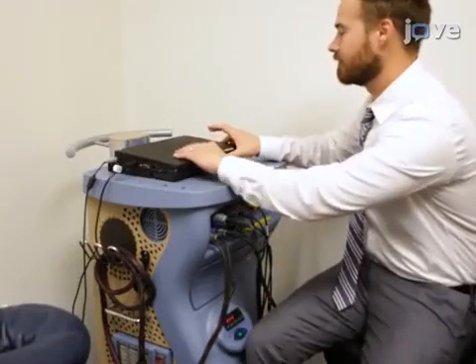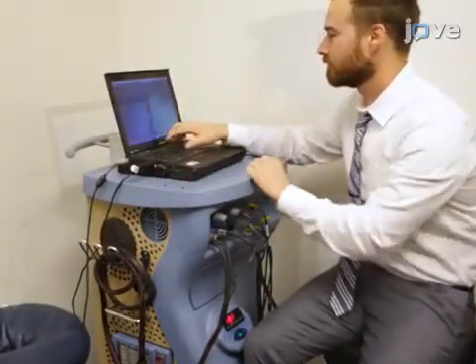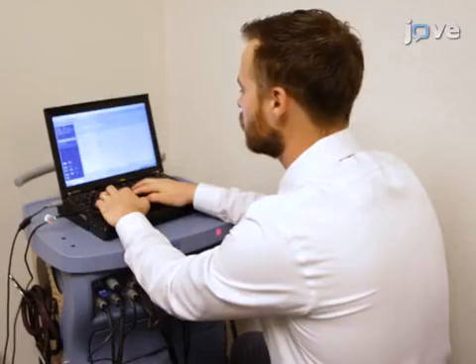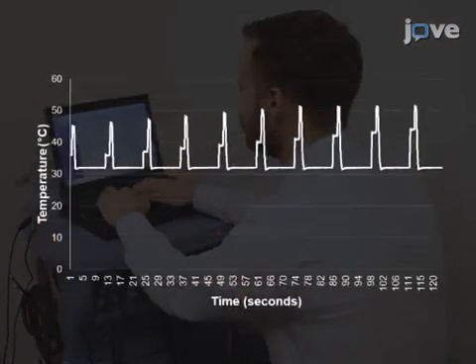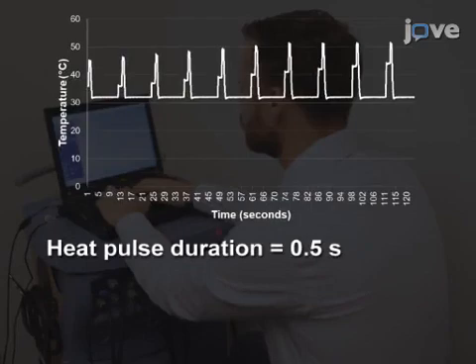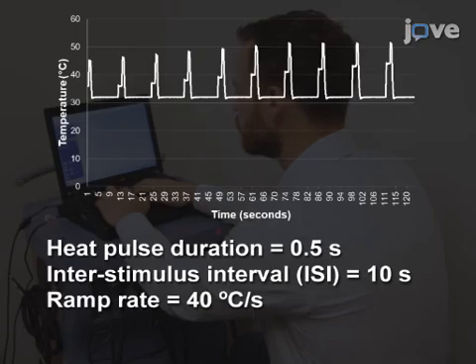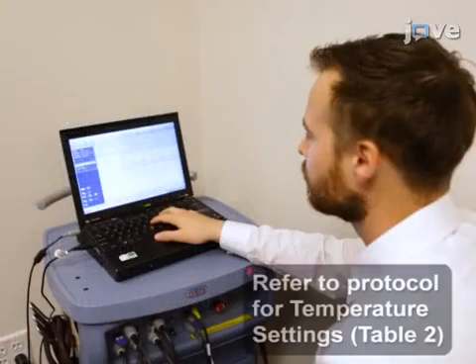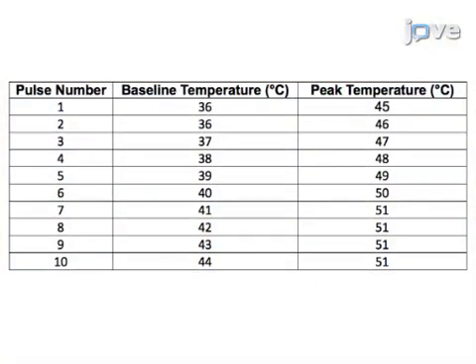Begin by turning on the thermode and the computer. Program the sequence of single heat pulses for training trial 1 with the following parameters: heat pulse duration equals 0.5 seconds, interstimulus interval equals 10 seconds, ramp rate equals 40 degrees Celsius per second. Then sequentially increase the baseline and peak temperature of each pulse according to the temperature settings table.